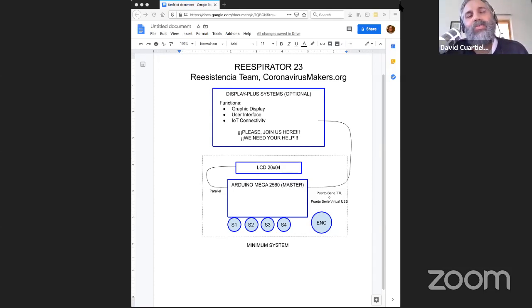And also using a sensor to monitor. Also, there was an option to control the flow with pressure sensing, but finally we are not using pressure sensing for the flow, but a dedicated flow sensor that is very, very precise. I think that's actually a really good tip, because maybe we are using pressure sensors instead of flow sensors. So this is a really, really good tip.